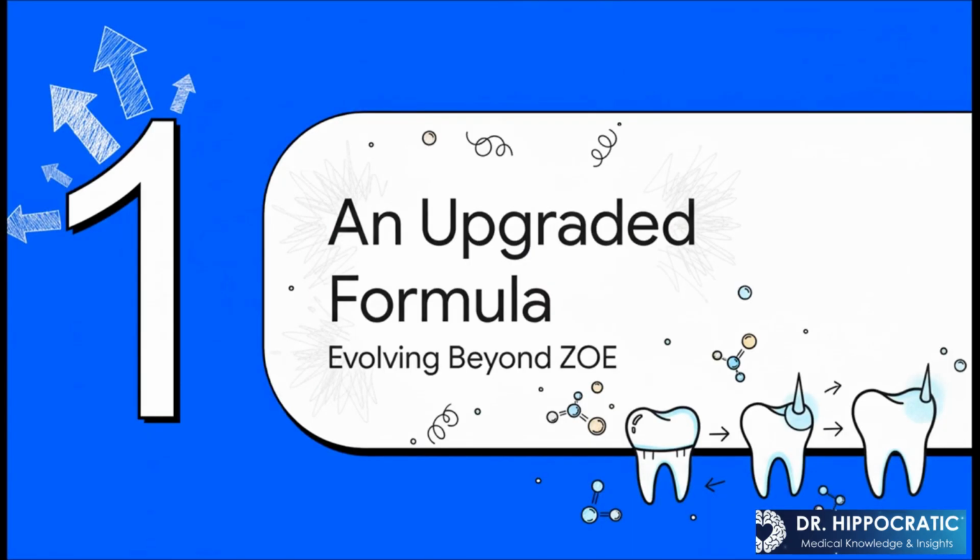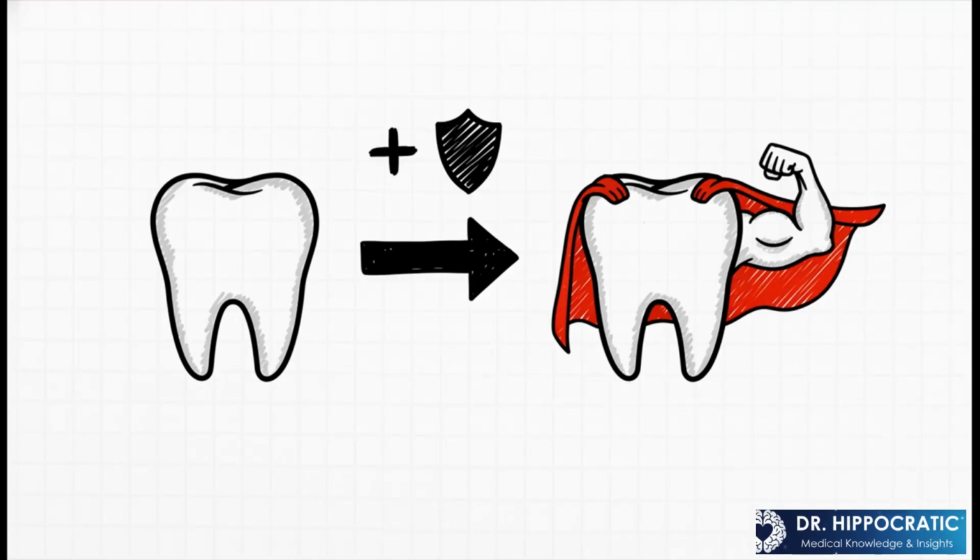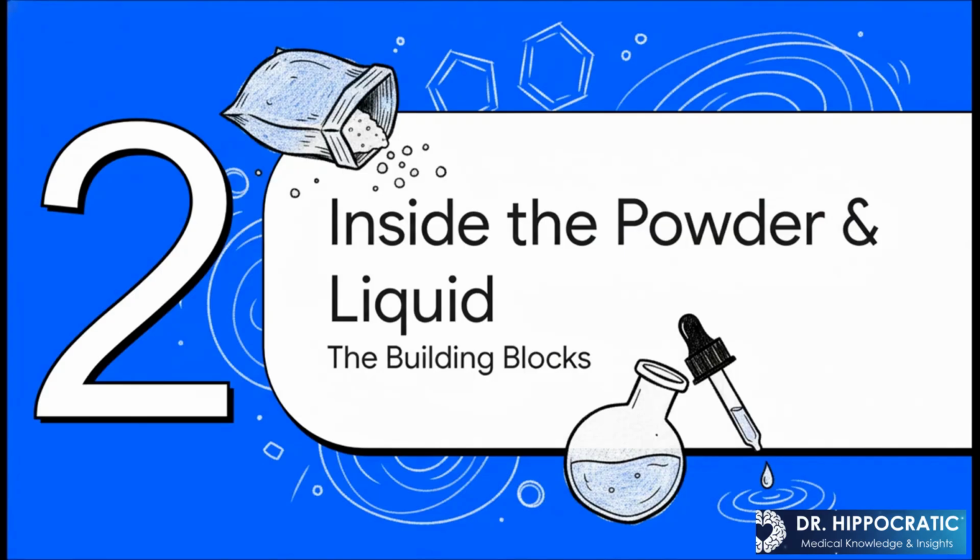So how do you improve on a classic? Well, you don't just throw everything out and start over. Instead, the smart folks who developed EBA cements took a material that dentists use constantly and zeroed in on fixing its one big weak spot. So here's the bottom line. EBA cement is basically a souped-up, reinforced version of ZOE. The whole idea behind its design was super simple. Keep all the good stuff about ZOE, but specifically engineer out its biggest problem, which was, of course, its lack of strength.